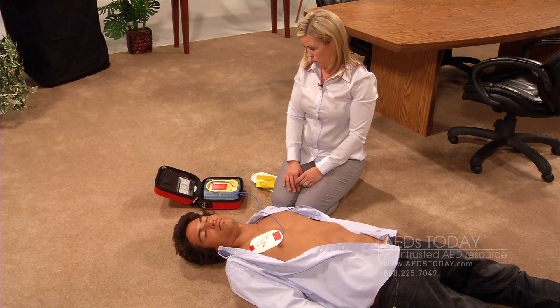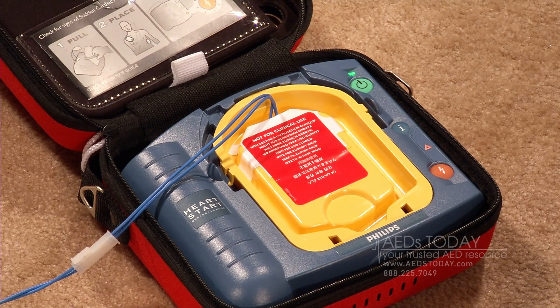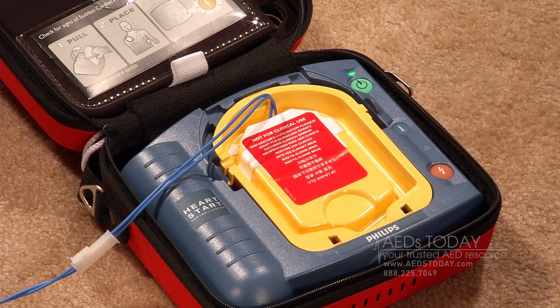Make sure no one is touching the patient. Press the flashing orange button now. Shock delivered.